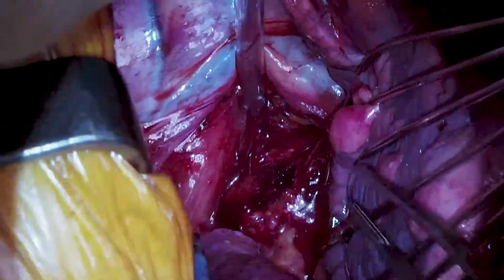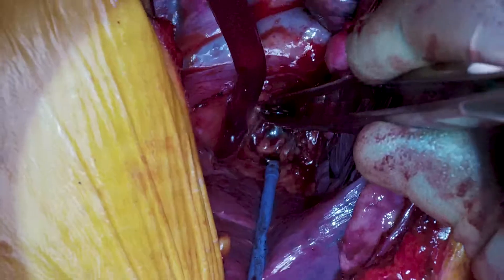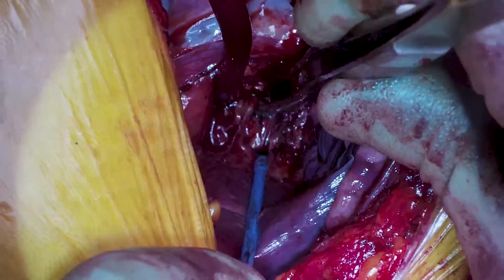This shows some more dissecting done at the sub-carinal station, which was not included in full as it would make the video too long.